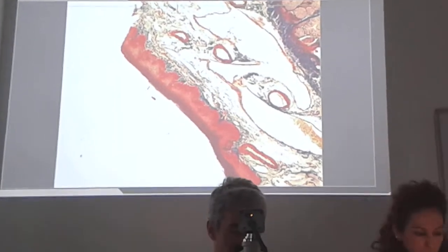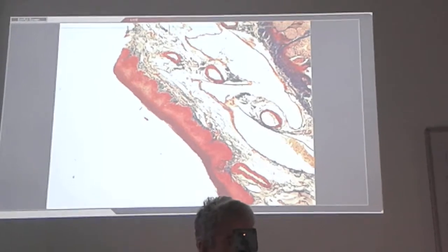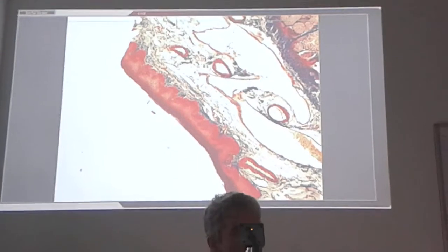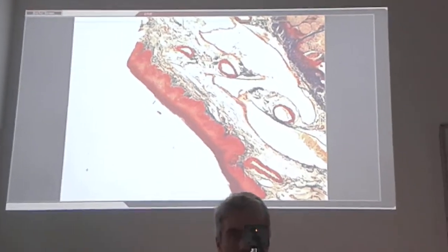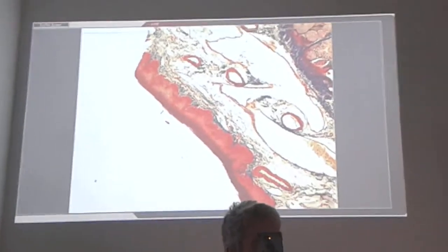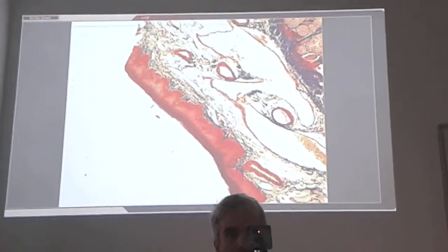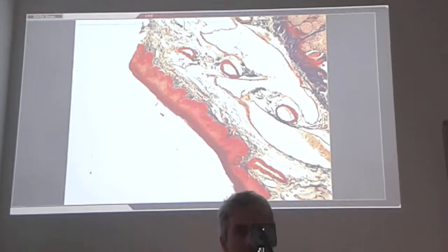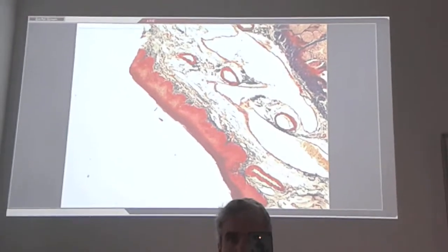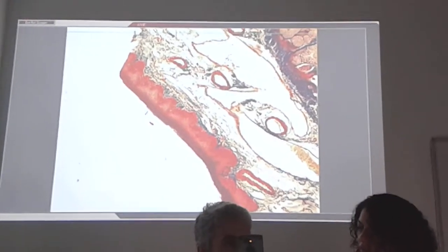Today we will see the digestive system tissues, tissue sections obtained from some organs. And during the lesson, to remind you, we were starting from the mouth. The upper part of the digestive system starts with the mouth, and then continues with the esophagus, and we will end up with the stomach today.